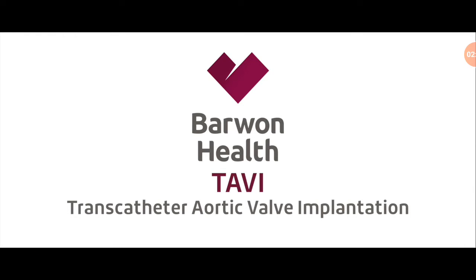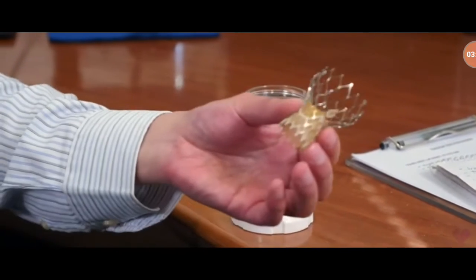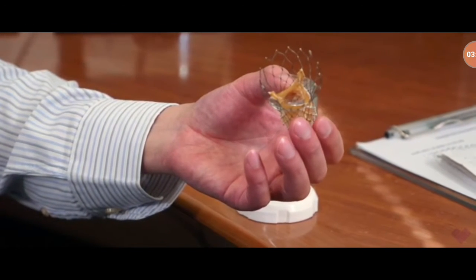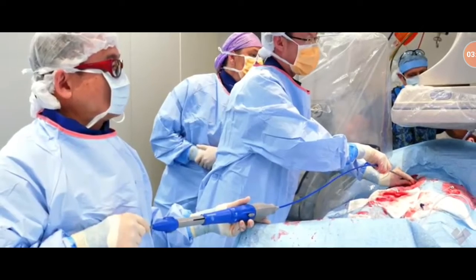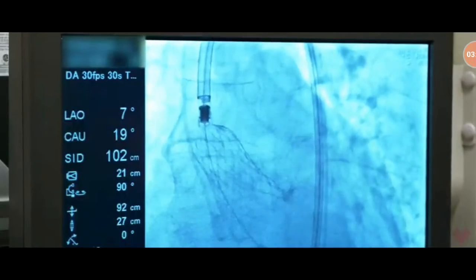TAVI means Transcatheter Aortic Valve Implantation. It started in France and it's been adopted in every major Western and Asian country. So it's a process where we implant a new aortic valve, which is one of the main valves in the heart, through a catheter. And basically we can insert this catheter through the main artery in the groin and push it up into the heart and deploy the new valve in where the original valve is.